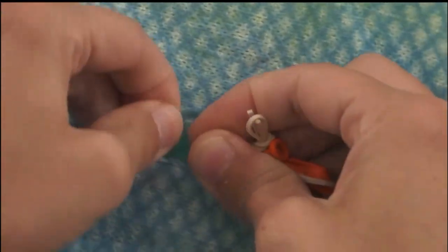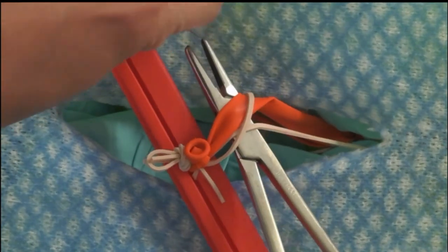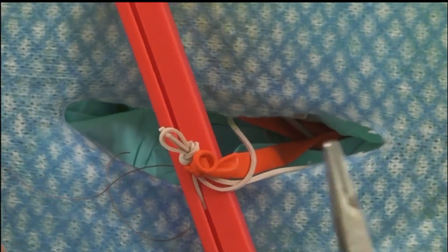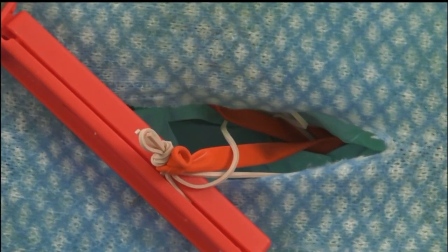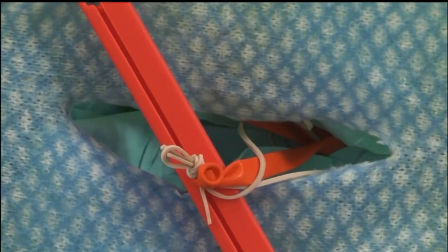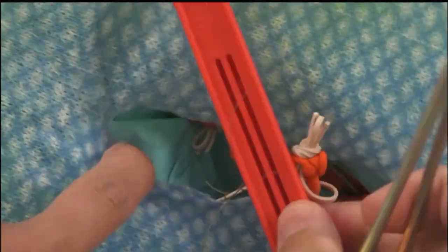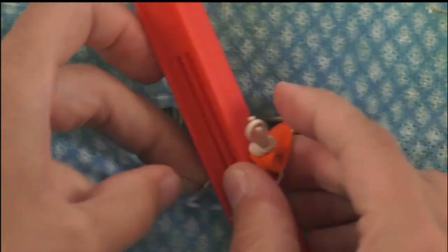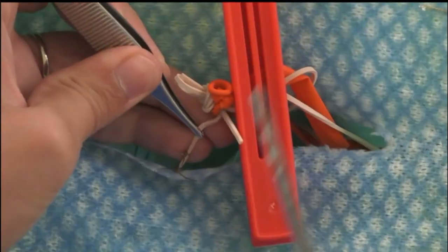Follow to the next side — there's the suspensory, snapped with fingers; there are the ovarian vessels. Use the length of the chip clip to help span the width of the incision, holding things outside the abdomen like a little assistant. Reposition your chip clip to practice getting things in the crush bed — you don't really need to do that with a cat, but with a dog you probably want to. That's how you prevent back bleeding from the uterine vessels that anastomose with the ovarian vessels.